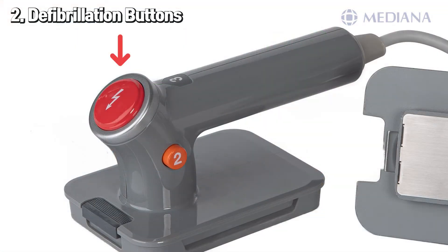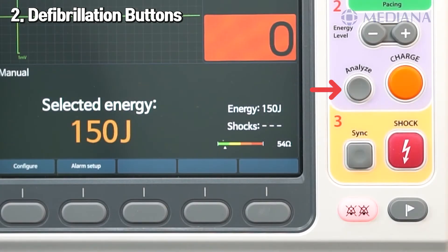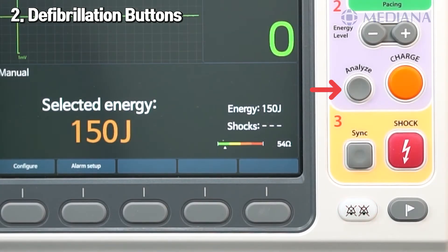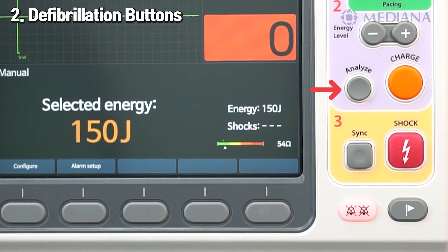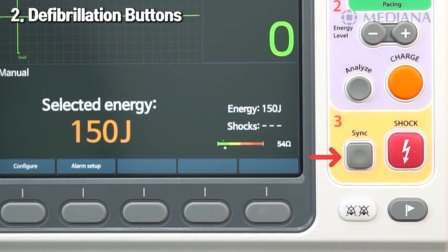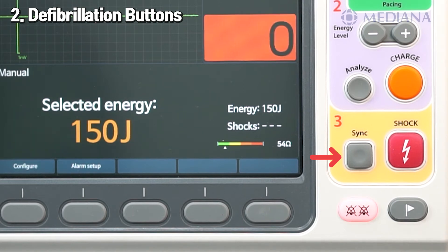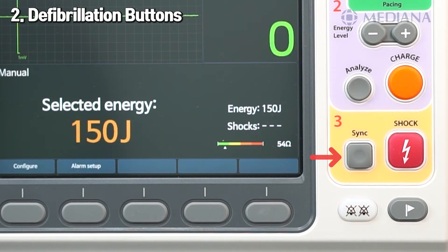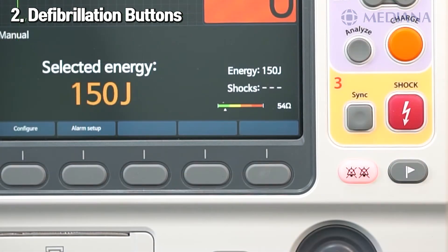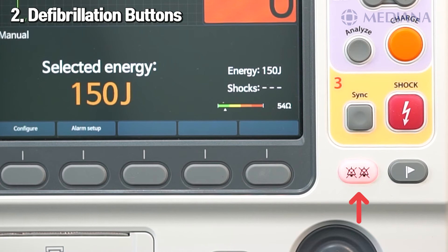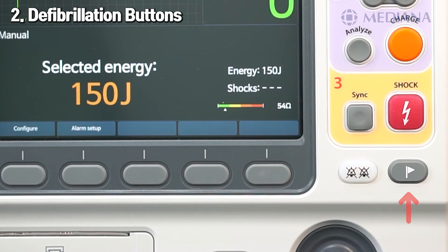To deliver the shock, there are two ways: press the shock button on the front side of the device, or press the shock button located on the external paddles. The analyze button operates the advisory mode to help determine whether defibrillation is carried out in manual mode. The sync button selects sync or async mode, which can be applied directly for user convenience. The alarm button pauses the audible alarm temporarily, and the event button selects and records event data.